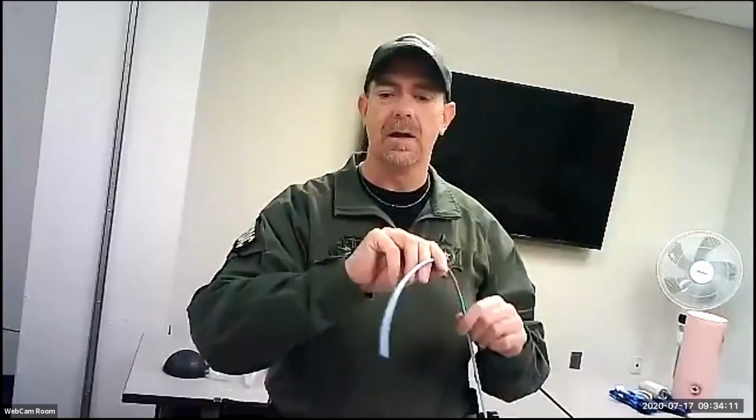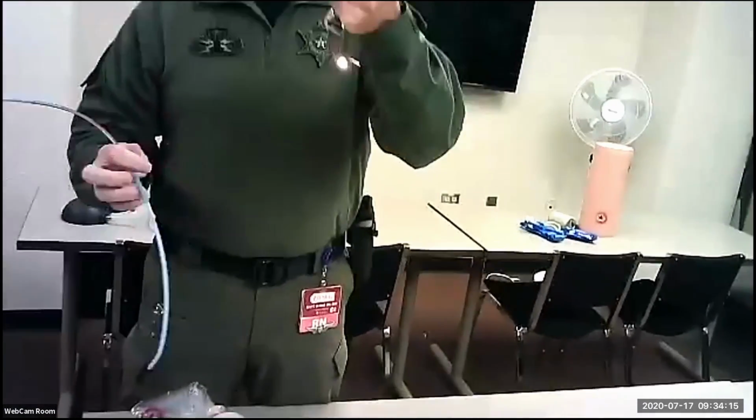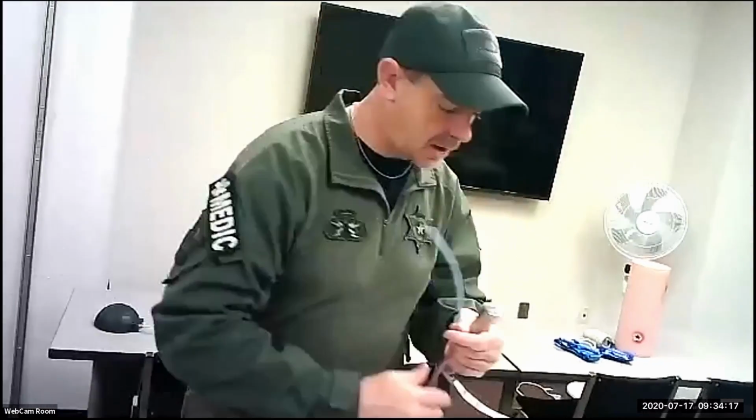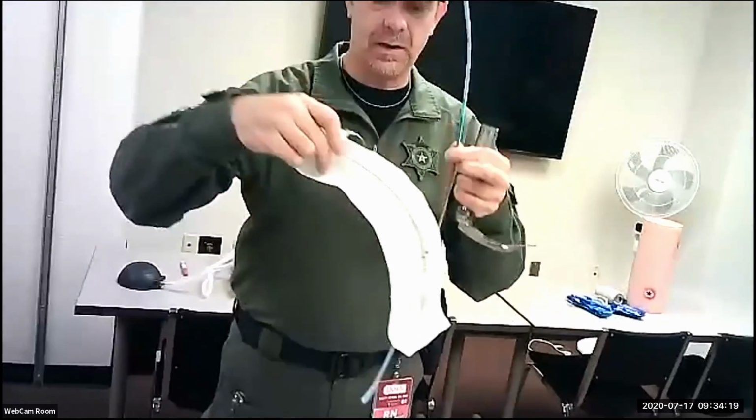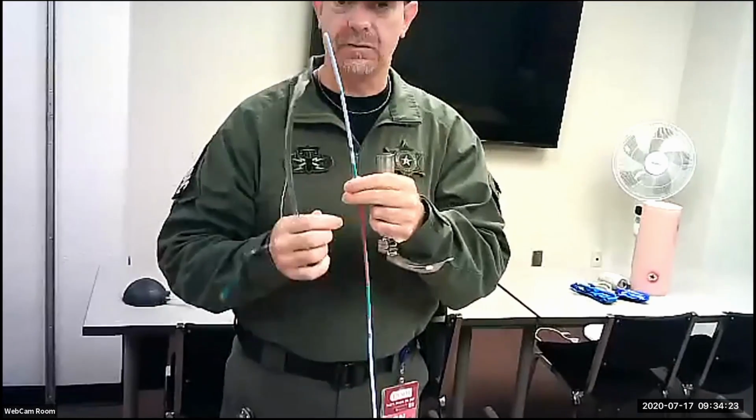So what a bougie is, and I'm going to demonstrate here in just a second, is that as I go into the mouth to look, instead of the actual breathing tube, which is this, I'm going to slide the bougie in first, and I'm going to demonstrate here in just a second.